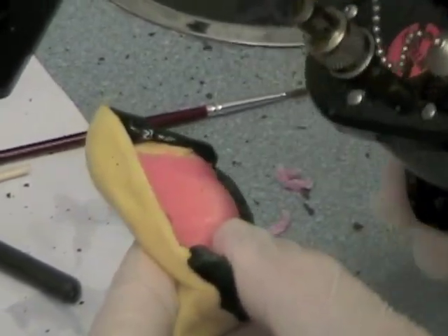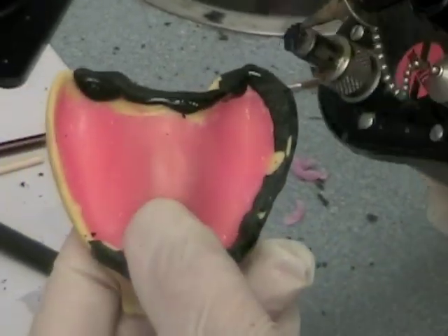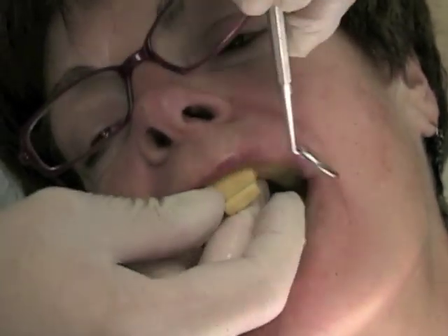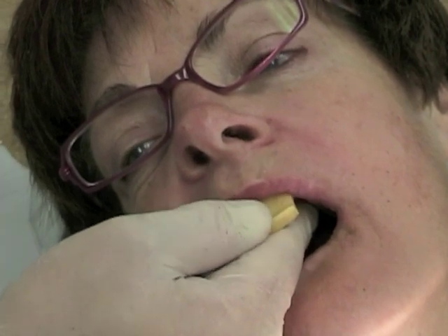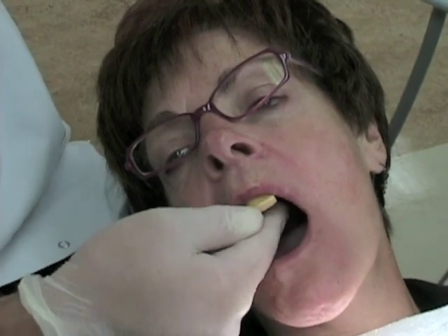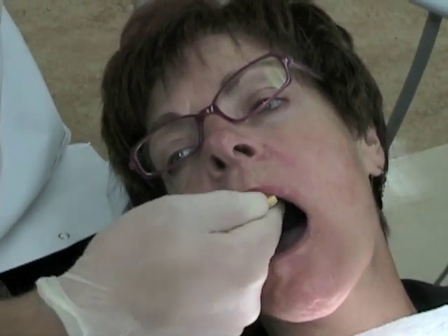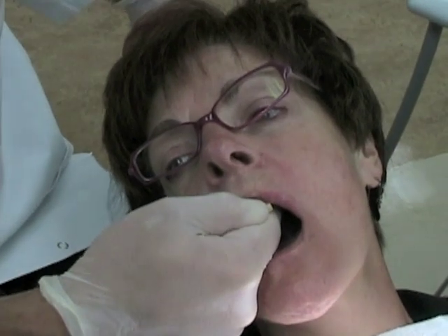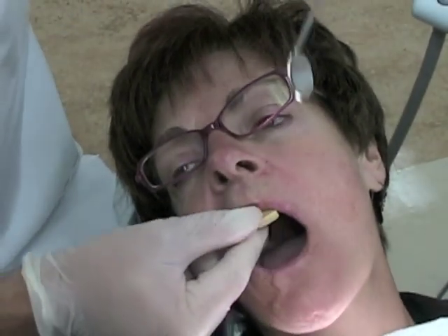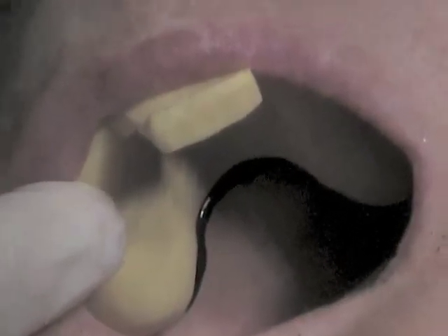Flame the compound with your torch and temper it back in the water bath. Then place it interorally under firm pressure, making sure the tray is fully seated. Have the patient open wide to activate the pterygo-mandibular raphae, and have them move from side to side so any coronoid interferences are eliminated. Intraorally, use your mouth mirror to check that the posterior border of the compound is not past the marked vibrating line.